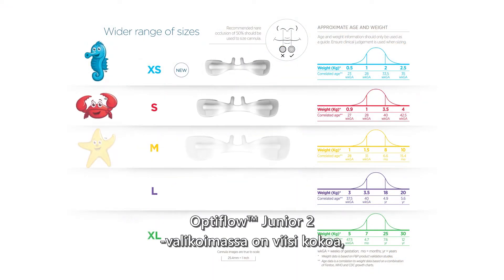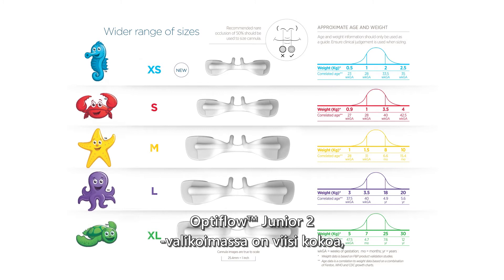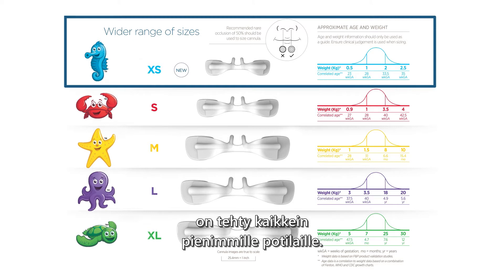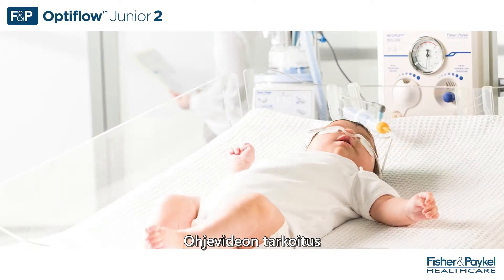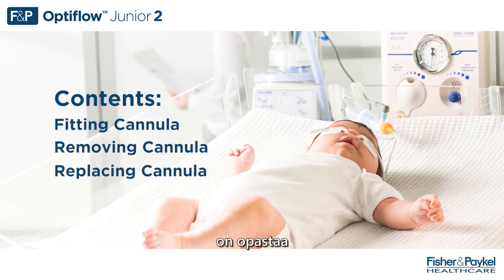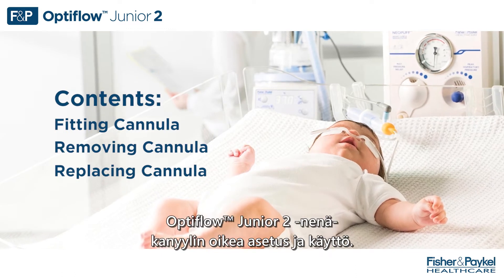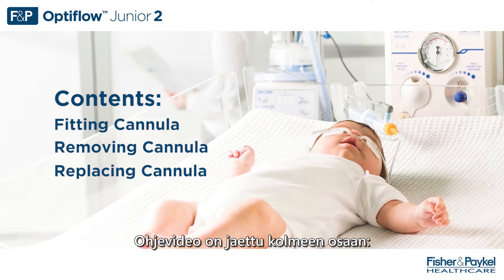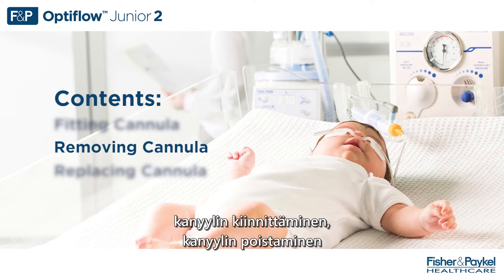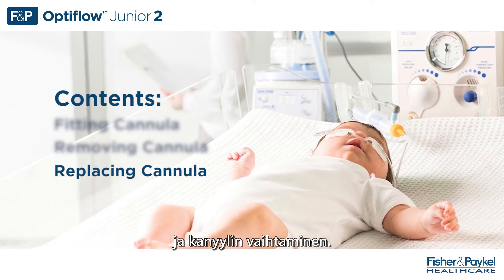Optiflow Jr. 2 has five sizes in its range, including our newest extra small cannula released for the smallest of patients. The purpose of this in-service video is to explain how to correctly fit and use the Optiflow Jr. 2 nasal cannula. This in-service video has been split into three parts: fitting cannula, removing cannula, and replacing cannula.